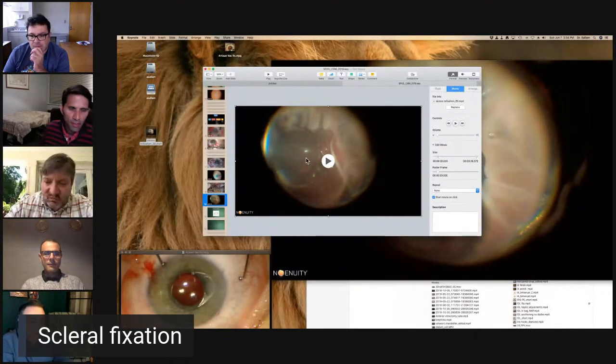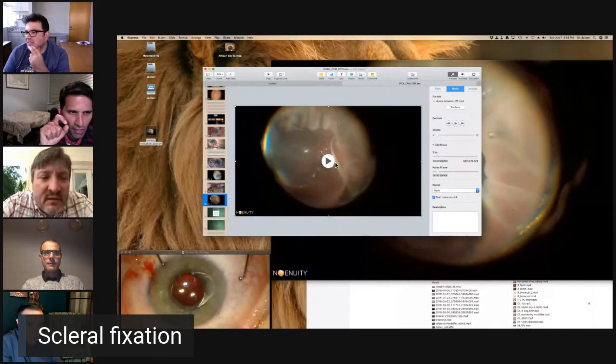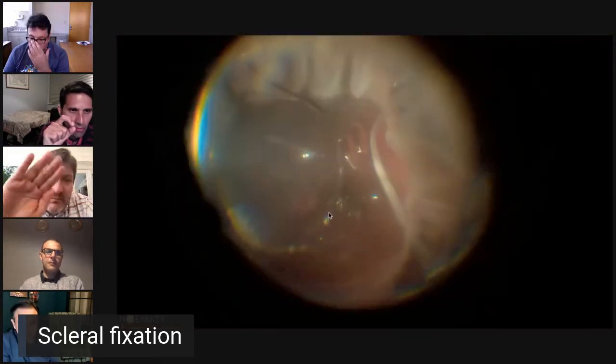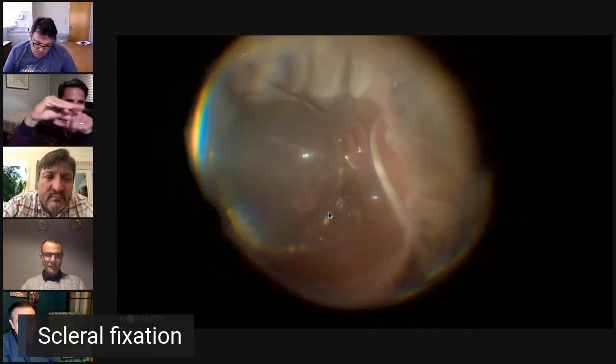Yeah. They're floating, so you make your life much easier if you use serrated forceps. And they're like stilettos, those ILM forceps. They're so sharp that if you grab them, they'll rip the thread, and they're more likely to miss it, whereas if you've got a nice crocodile forceps, you know.